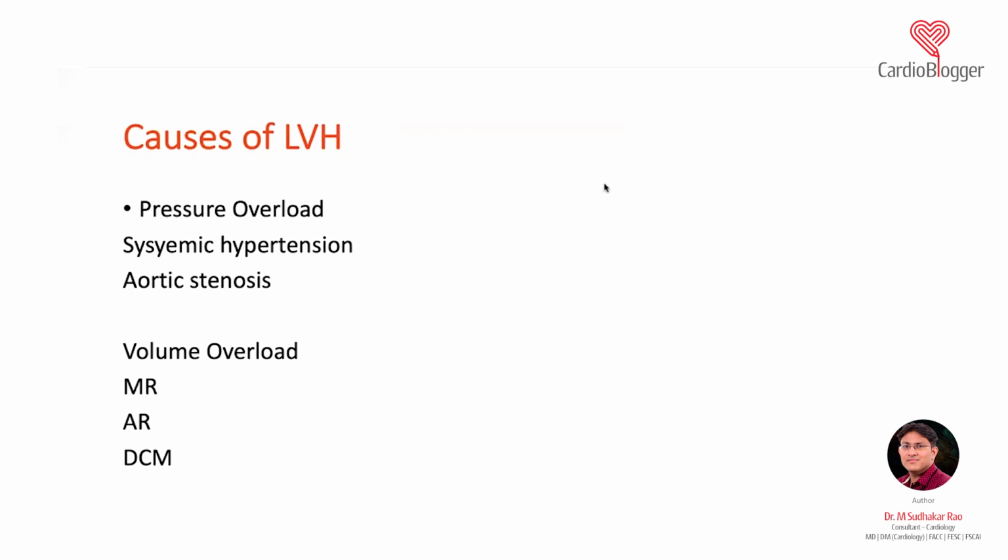So what I actually wanted to convey is that chamber enlargement by ECG is an important thing which all of us should know. But before ECG, you should also know chamber enlargement by chest X-ray, though this topic is about the ECG. The first thing is, it is very difficult to miss LVH on ECG because most of us will know the obvious high voltages.